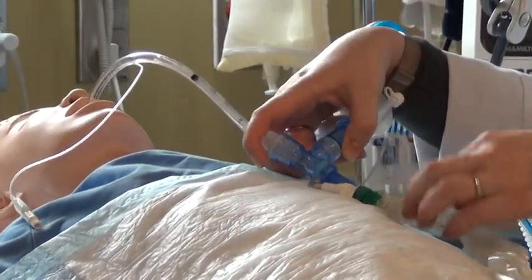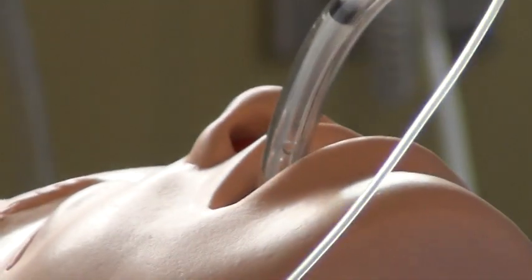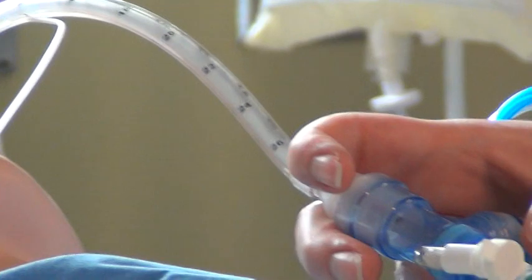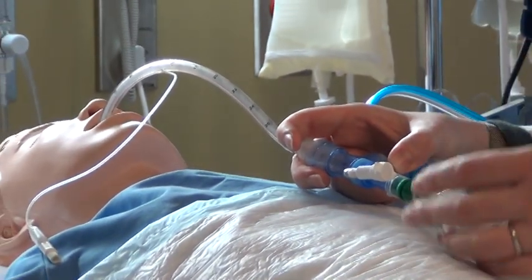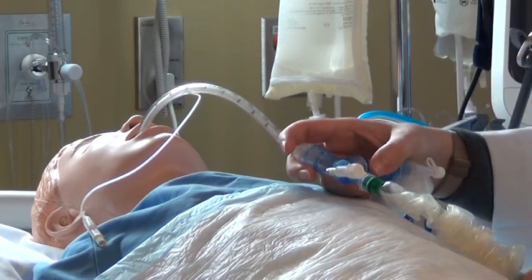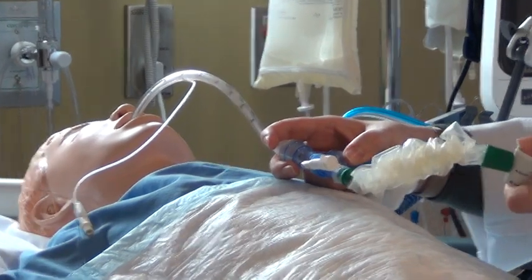catheter inside the lungs. As you may see here, there's a little black mark here, and that's just moving into the lungs. So this suction catheter is going in, and there are gratings on this suction catheter that we are able to see how deep we go. So once we go for our first suction, we have a general idea of how deep we must go, because as we push, we will feel the carina, so we won't be able to go any further. We always, once we feel the carina, pull back just a little bit to ensure that we're not going to suction the carina and injure the membrane. And then we start pressing on our button, which will be our suction.